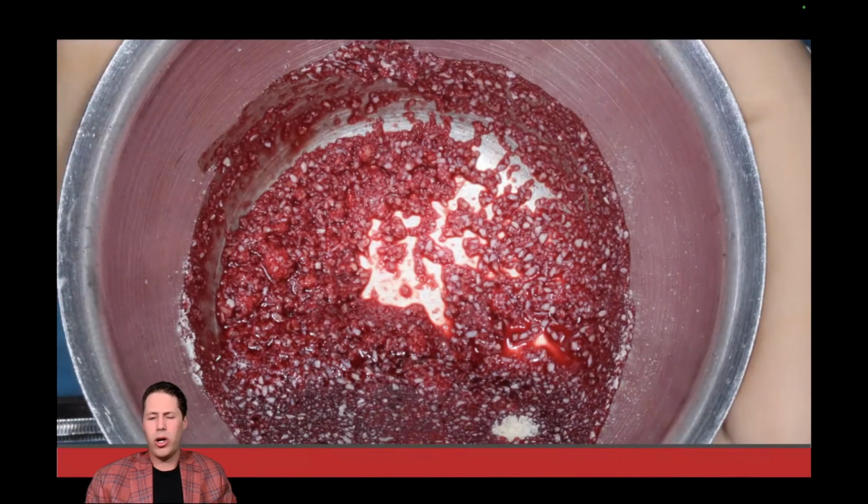When it comes to large grafting cases, I tend to use a bone graft that resorbs more slowly. So in this case, I used a mineralized cortical graft, small particle. I tend to hydrate my graft in whole blood, and then I use an Nd:YAG laser on the hemostasis setting, a long pulse duration, 550 microseconds or 650 microseconds, to get good hemostasis. This bone will be much like sticky bone using PRF. I like to hydrate my bone in whole blood. So this just shows a photo of the graft hydrated in the whole blood.